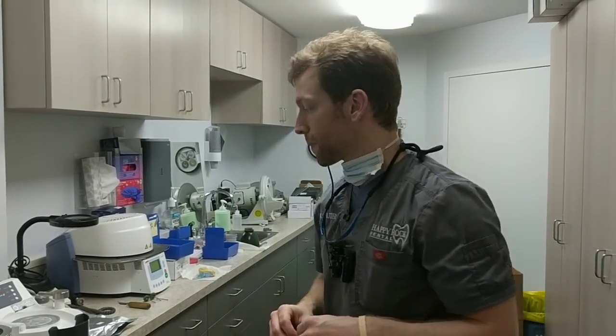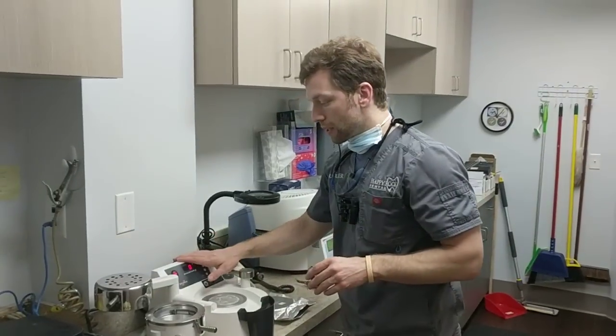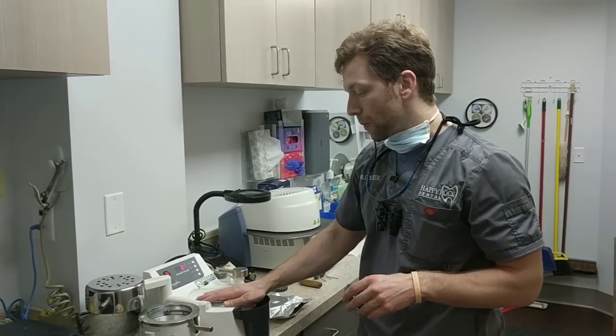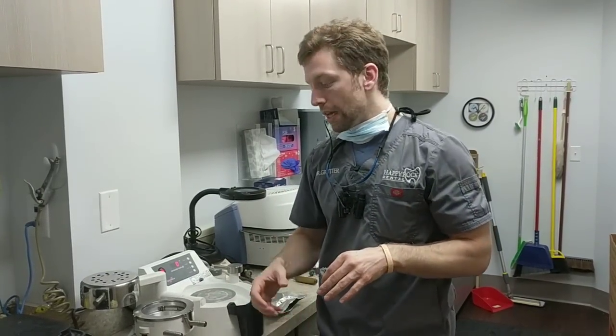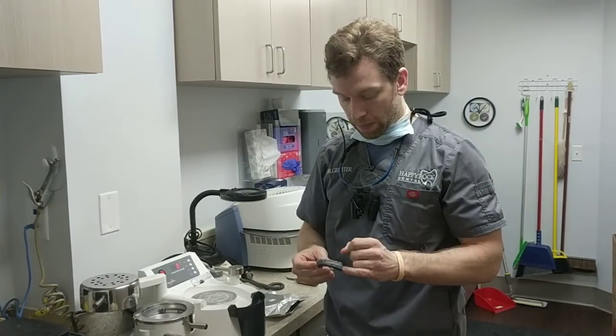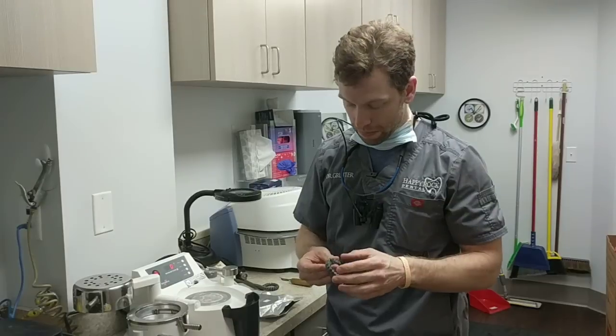Step two will actually be the first functional liner that will start moving the teeth. This is the MiniStar — you can get this at Great Lakes Ortho. It's a positive pressure machine, so instead of a suck down where it creates a vacuum and pulls the material tight, it actually uses positive pressure to push it down. It does a much better job of getting the aligner down into the crevices and the embrasures — much better adaptation.